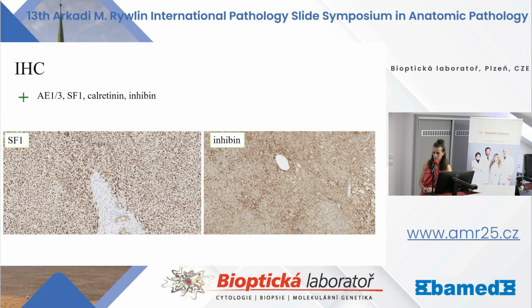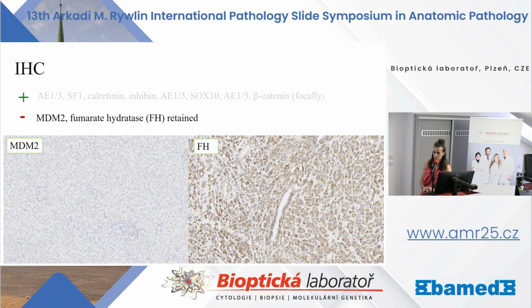Immunoprofile of this tumor: there was a diffuse positivity for SF1 and a little bit weaker positivity for inhibin, but also diffuse, pretty much the same positivity for calretinin, and also positivity for broad spectrum cytokeratins. We also performed other immunohistochemical stains, which were rather important for assessing the biological behavior of the tumor, which I will explain later.